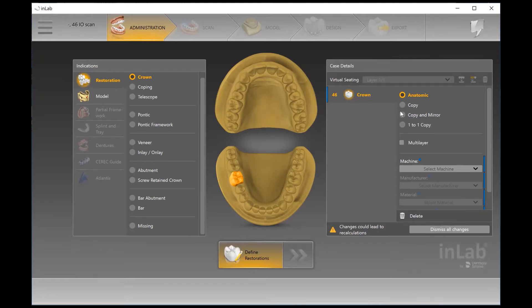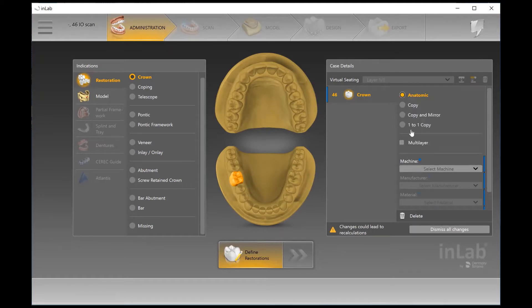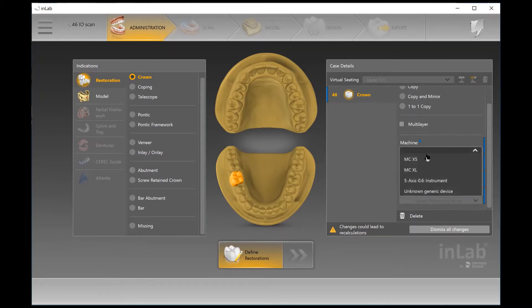An example of that would be for a partial framework to fit properly. Copy and Mirror comes in handy for cases where you want symmetry, especially in anterior teeth. And One-to-One Copy is ideal for complex cases like all-on-x, where you want to copy a try-in or a wax-up.